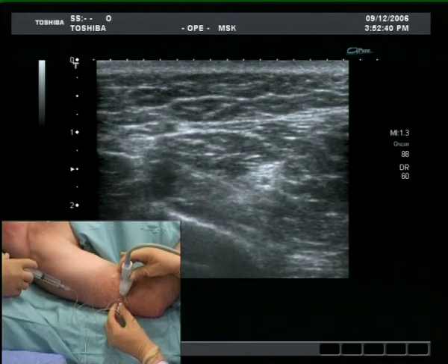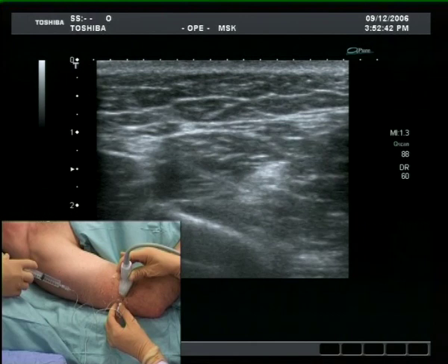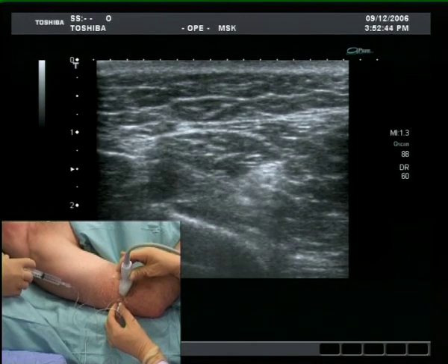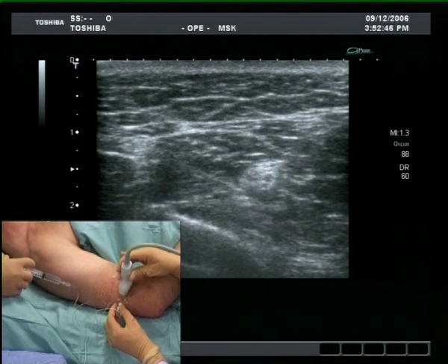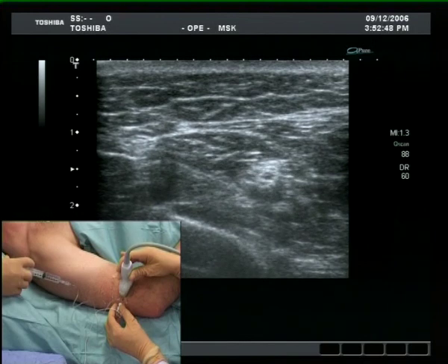Further injections of one to two mils of local anesthetic are made, moving the needle carefully with the aim of surrounding the nerve with low pressure.